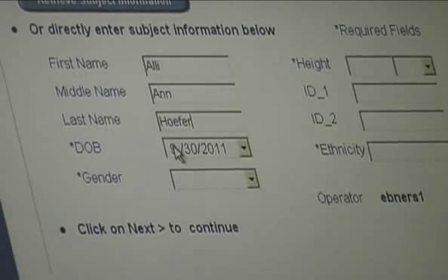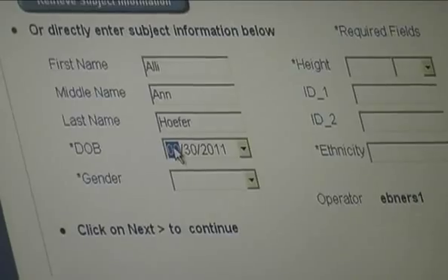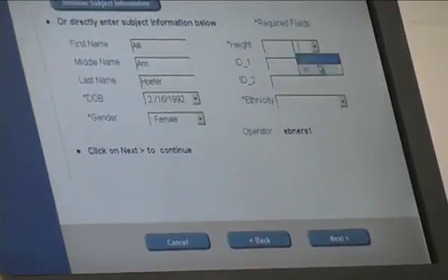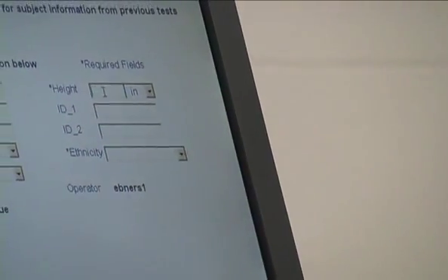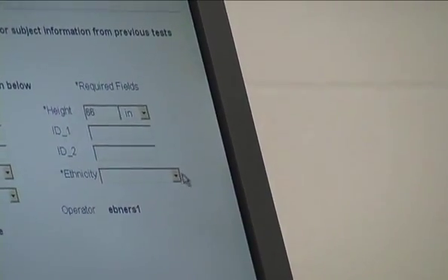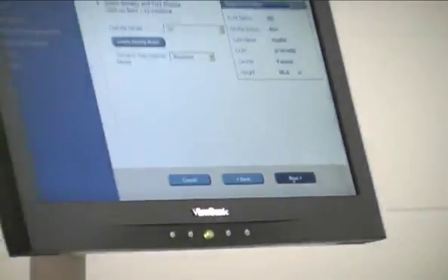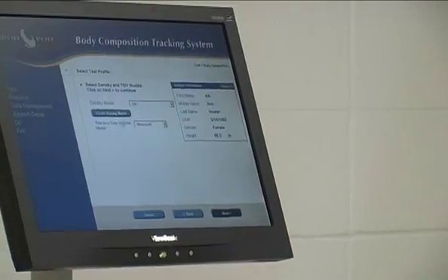Date of birth. 0216. Any of the fields that have an asterisk, those are required. The fields that don't have an asterisk, those are not required. So you may run into situations, HIPAA, privacy laws, you don't have to put in people's names. Inches. General population. So these are the defaults, they look good. Okay.